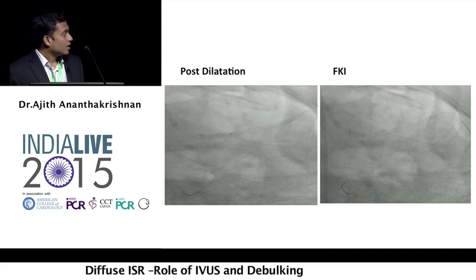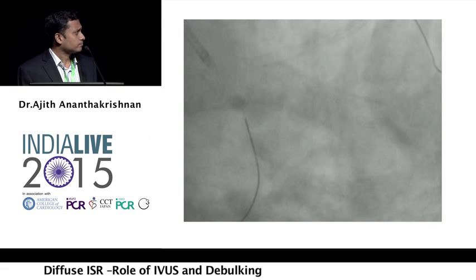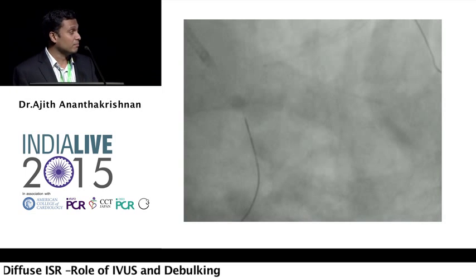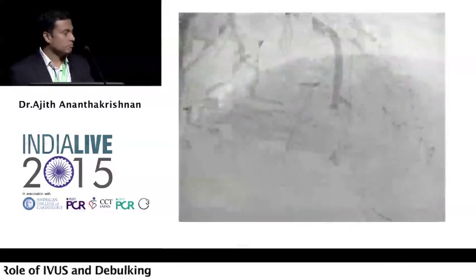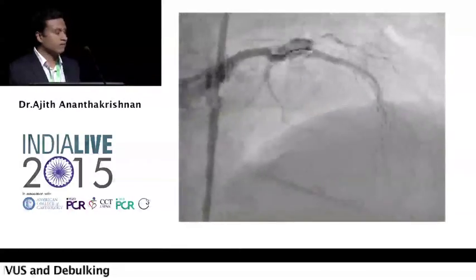Now, this was angiography after the stenting. More importantly, we deliberately avoided balloon dilatation of the distal bed, because we'd end up in messy dissections and then outflow occlusions, which eventually will damage all the good work we have done proximally. So the idea was actually to do a standalone rotablation of the distal bed and then optimize the stenting of the proximal and mid LAD coming back to the left main.